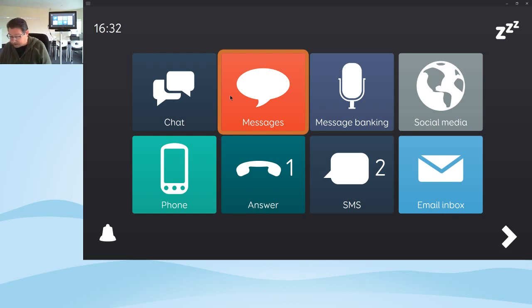Okay, so I can see a question here about a chat cell for when you're on the phone, and is it possible to add a cell that says something like, please bear with me, I'm using a communication aid. And the answer is that yes, you could certainly do that.